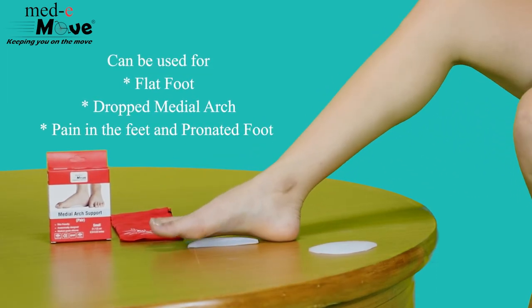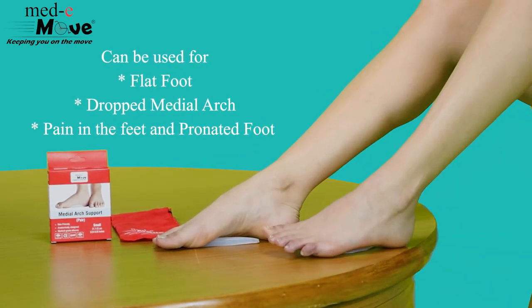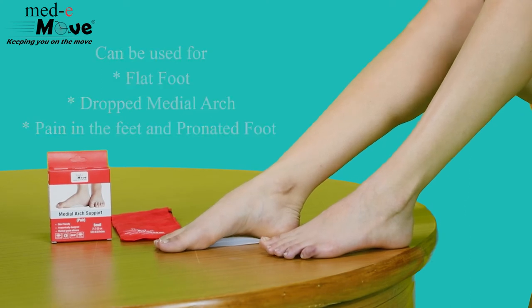Medimove medial arch can be used for flat foot, dropped medial arch, pain in the feet, and pronated foot. Simply remove the feet and the arch support for easy removal.